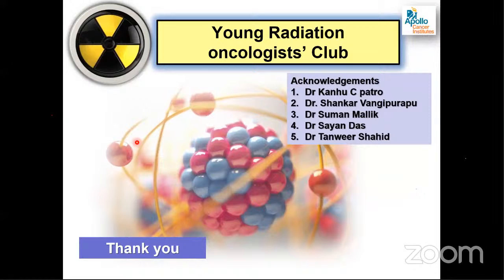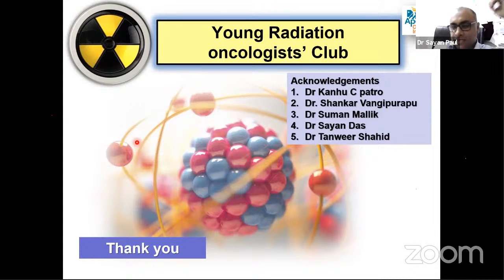Perfect. What exactly is the added advantage ExactTrack offers in a hybrid system compared to KVCT alone? Yes, the first advantage is very, very fast. Within 10 seconds, you get the image. So we did a small study and I presented it in ISTRO. The study was time dependency of errors. I took intra-fraction images with ExactTrack. So during the treatment, I took image and we generated a model and we saw that for SBRT planning, if the treatment duration increases, the error increases.